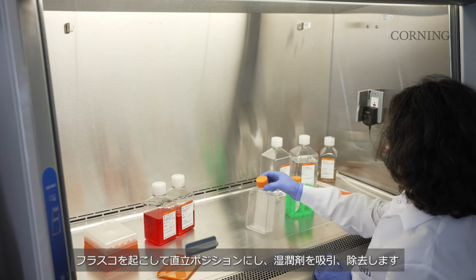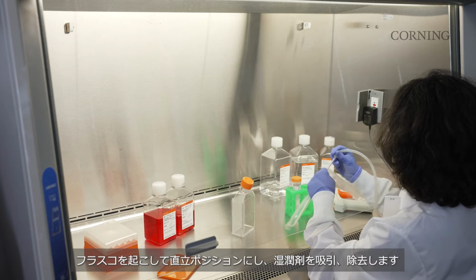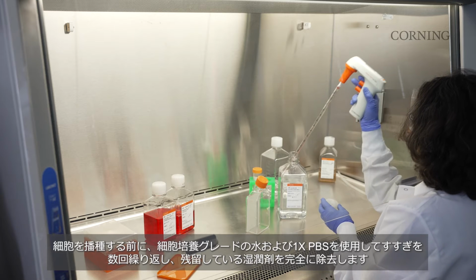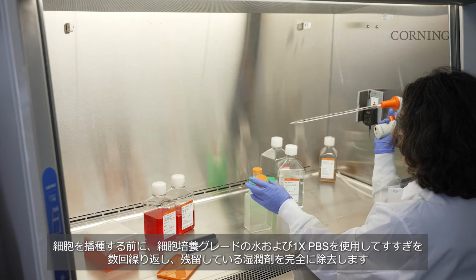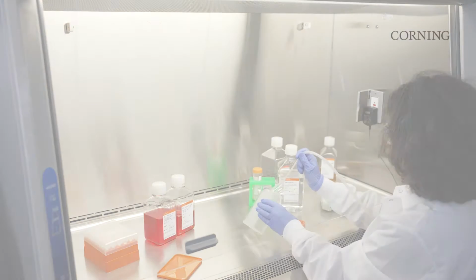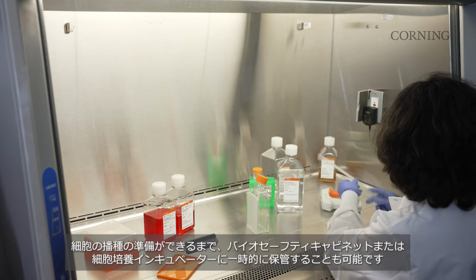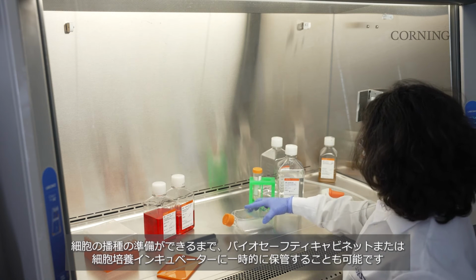To remove the wetting agent, bring the flask back to the upright position and aspirate. The microcavity surface should be rinsed several times with water and 1x PBS to remove residual traces of the wetting agent prior to seeding cells. The flask can now be used to seed cells immediately, or can be stored temporarily in a biosafety cabinet or cell culture incubator until cells are ready for seeding.